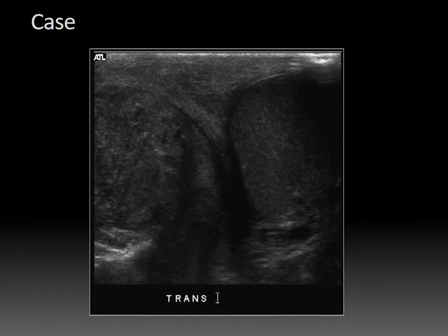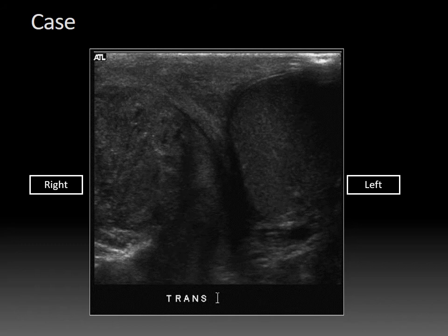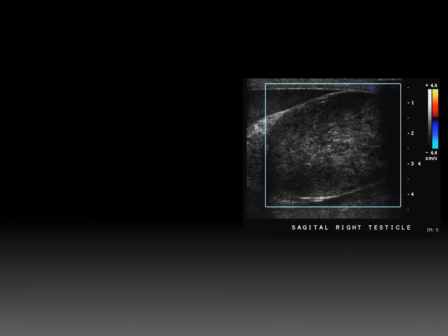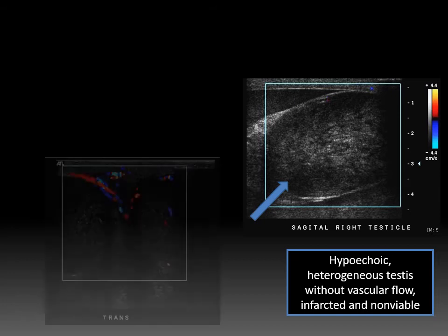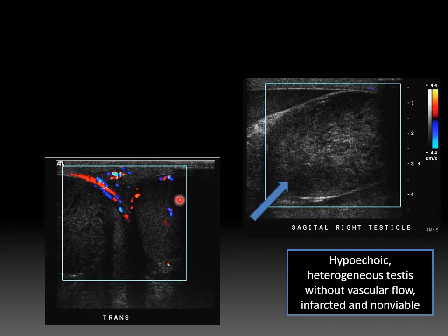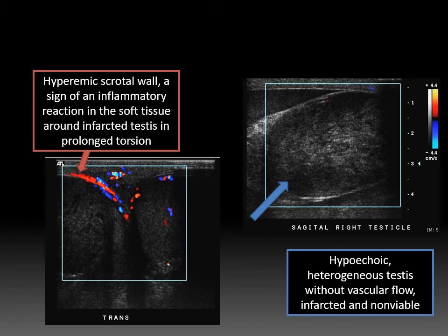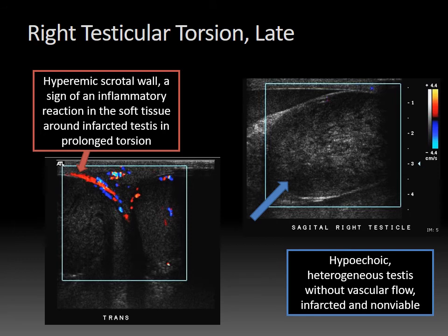This is a transverse image showing both the right and left testicles. The right testicle is markedly heterogeneous on grayscale images. With color Doppler, there is absolutely no intratesticular vascular flow. Given that the testis is heterogeneously hypoechoic with no flow, this is consistent with an infarcted non-viable testis — this testis will likely need orchiectomy. The left testis has normal vascular flow. There is a peripheral curvilinear region of hyperemia within the scrotal wall, an inflammatory reaction sometimes seen in the soft tissue in the setting of prolonged torsion with an infarcted testis — typical for late testicular torsion. With early torsion, you often have no grayscale changes and just loss of vascular flow, and those patients need emergent treatment because the testis can be salvaged.